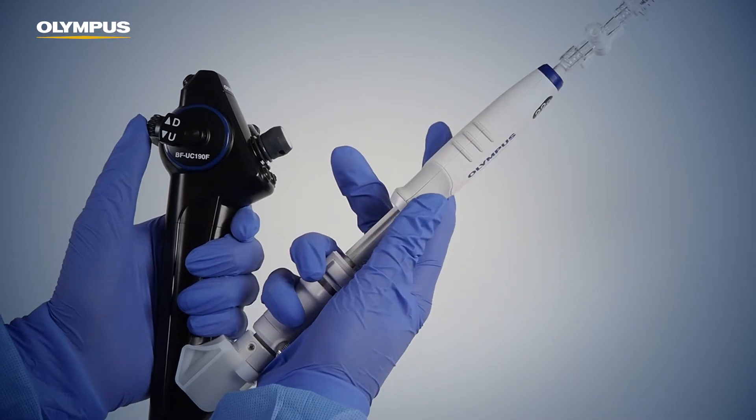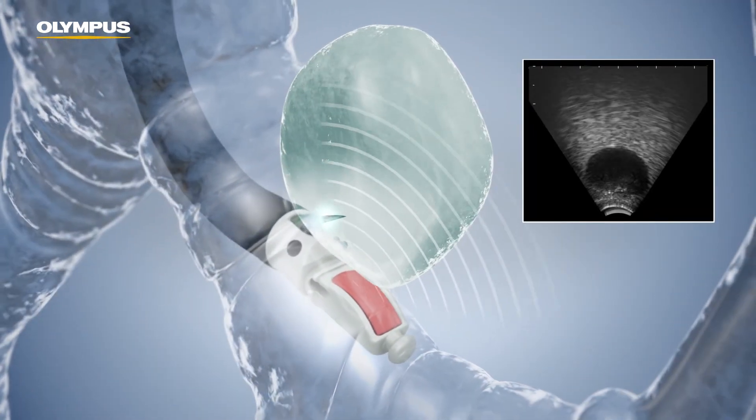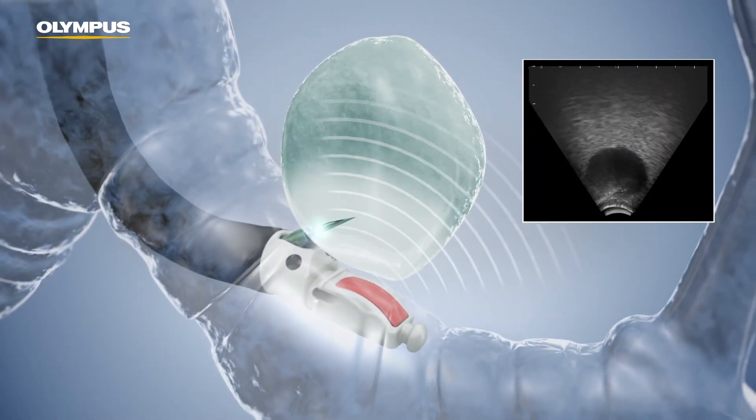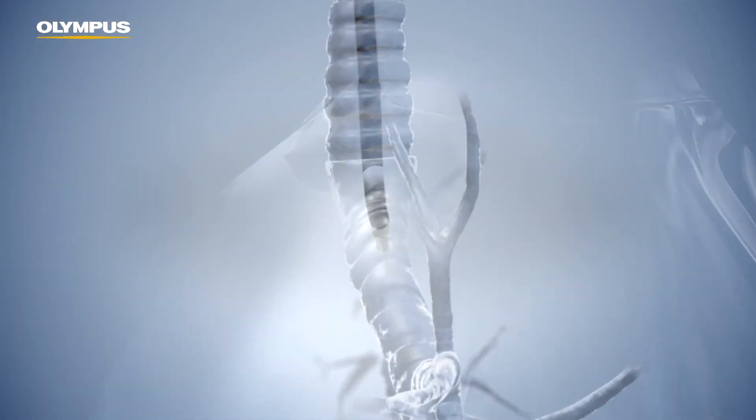Attention! Once the eBus TBNA needle has penetrated a lesion, it is important not to move the arm holding the endoscope handle, as this would move the needle out of the focus and out of the imaging area of the ultrasound transducer. The real-time control of the needle would no longer be possible.